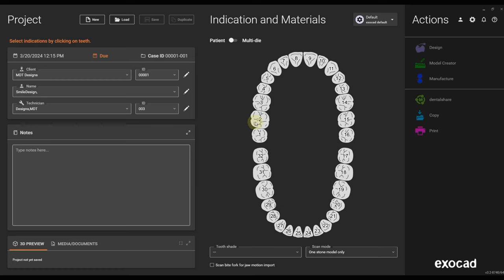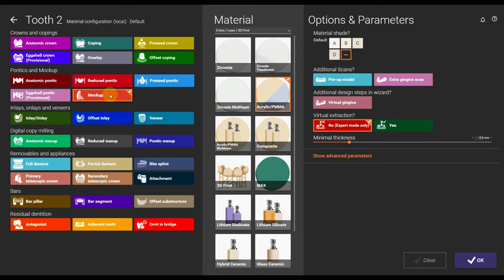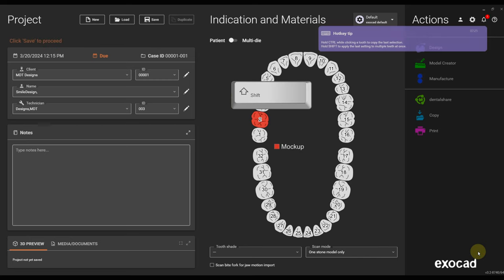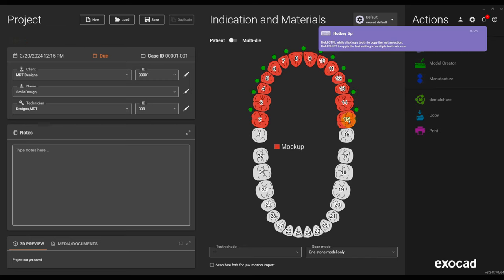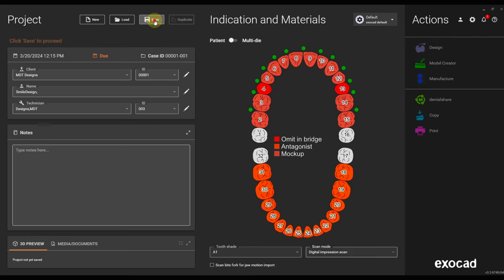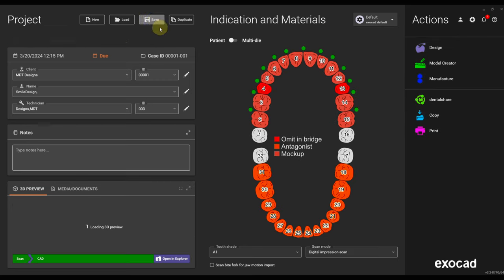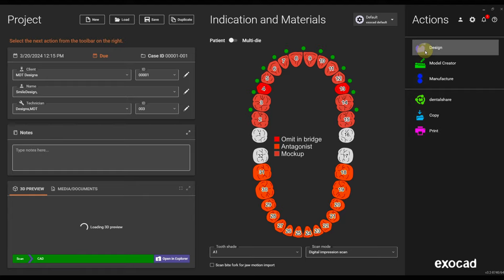Our journey starts in the order form. We're gonna choose mock-up — that's the best option for smile design cases. We're gonna save the order and go right into design.